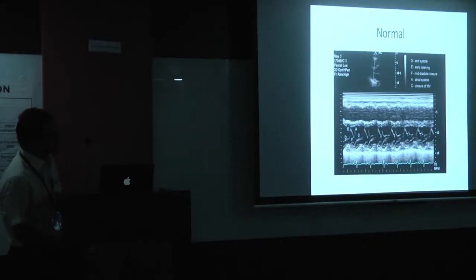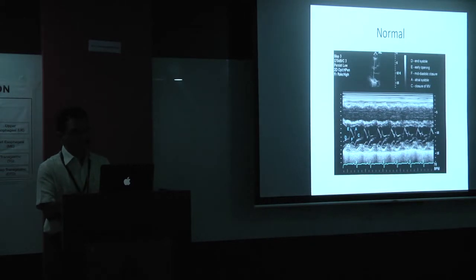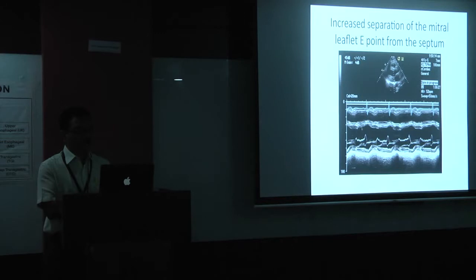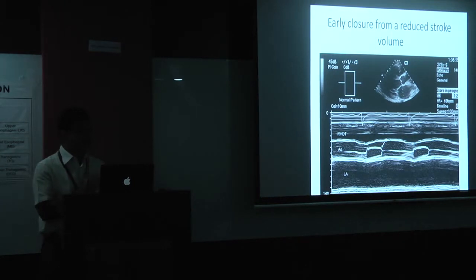In the normal M-mode across the LV in the basal segment on parasternal long axis transthoracic echo, you can see the septum, the inferolateral wall, and the mitral leaflet E wave. Note the proximity of the E point to the septum — that's quite normal. In dilated cardiomyopathy, there is quite a bit of distance — an increased E-point septal separation. On M-mode of the aortic valve, there is an early closure due to reduced stroke volume in dilated cardiomyopathy.